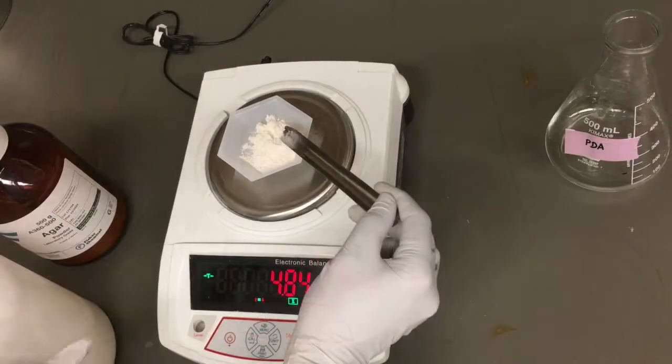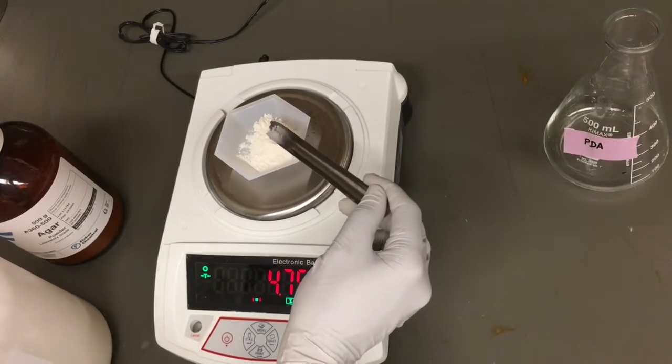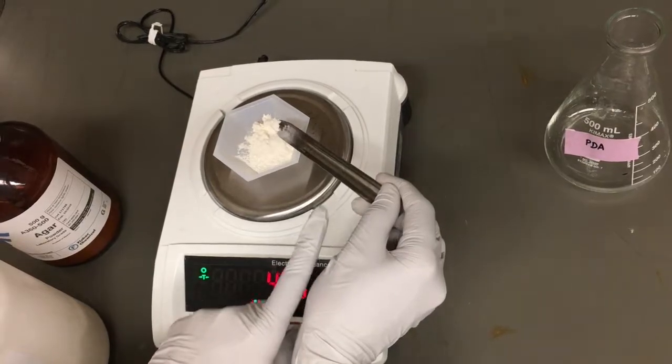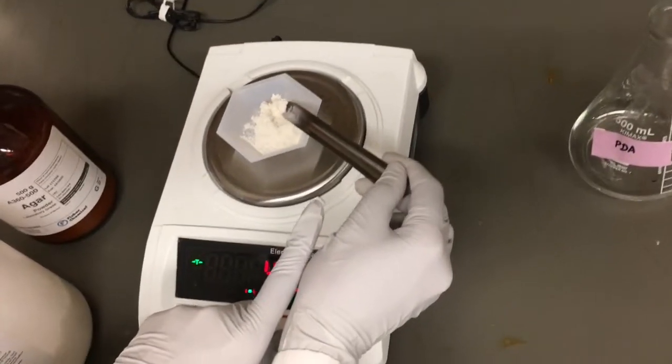Slowly add the powdered media while weighing. If you add too much, remove it and adjust until accurate. You want to dispose of excess to the waste and never back into the bottle.